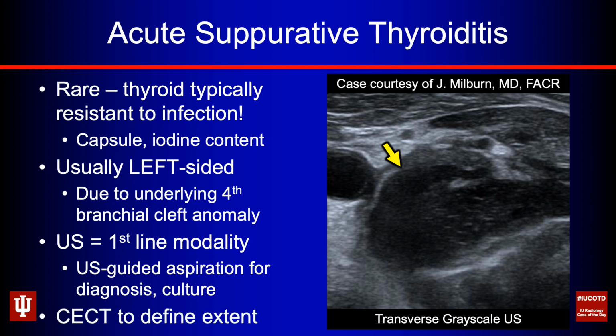Can you use CT? Sure. CT is a helpful tool. It's probably better than ultrasound in some ways for looking for extrathyroidal extension and better defining the extent of infection and inflammation in the neck. But thyroid ultrasound really is kind of our first-line modality in these patients.